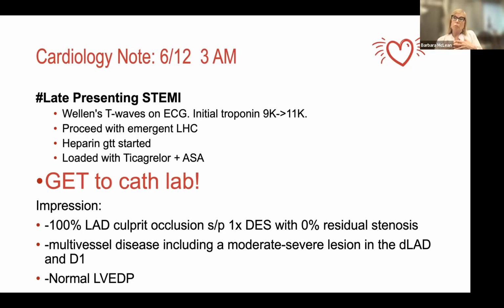So I'm actually disappointed myself that I couldn't look at that and say, oh, this is a late presenting STEMI with Wellens T-wave changes on EKG. I didn't do that. The medical attendings in the emergency department didn't do that. When cardiology came, it wasn't a resident, it was a fellow, pretty high up the cardiology chain, who says, hey, we've got to get to the cath lab right now. This patient has Wellens T-wave changes on EKG, and most importantly, the patient has a significant profound troponin bump.